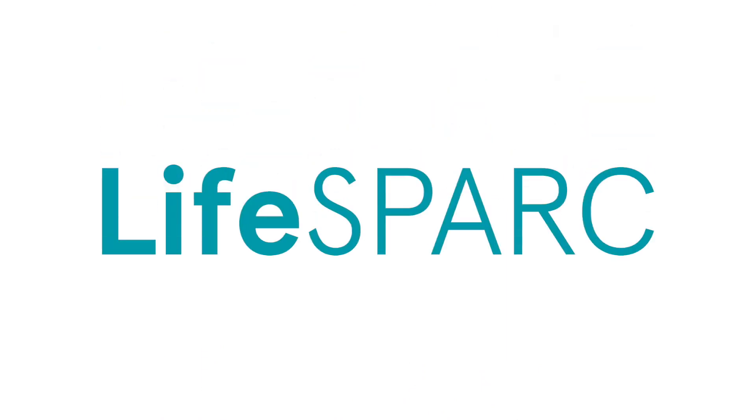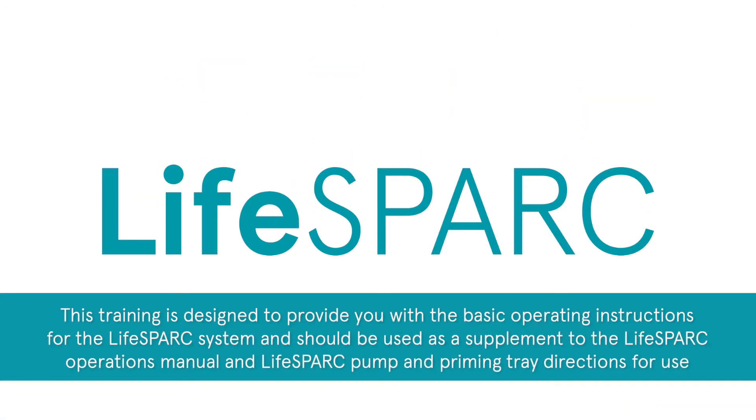Hello and welcome to the LifeSpark system pump and controller setup. This training is designed to provide you with the basic operating instructions for the LifeSpark system and should be used as a supplement to the LifeSpark operations manual and LifeSpark pump and priming tray directions for use.